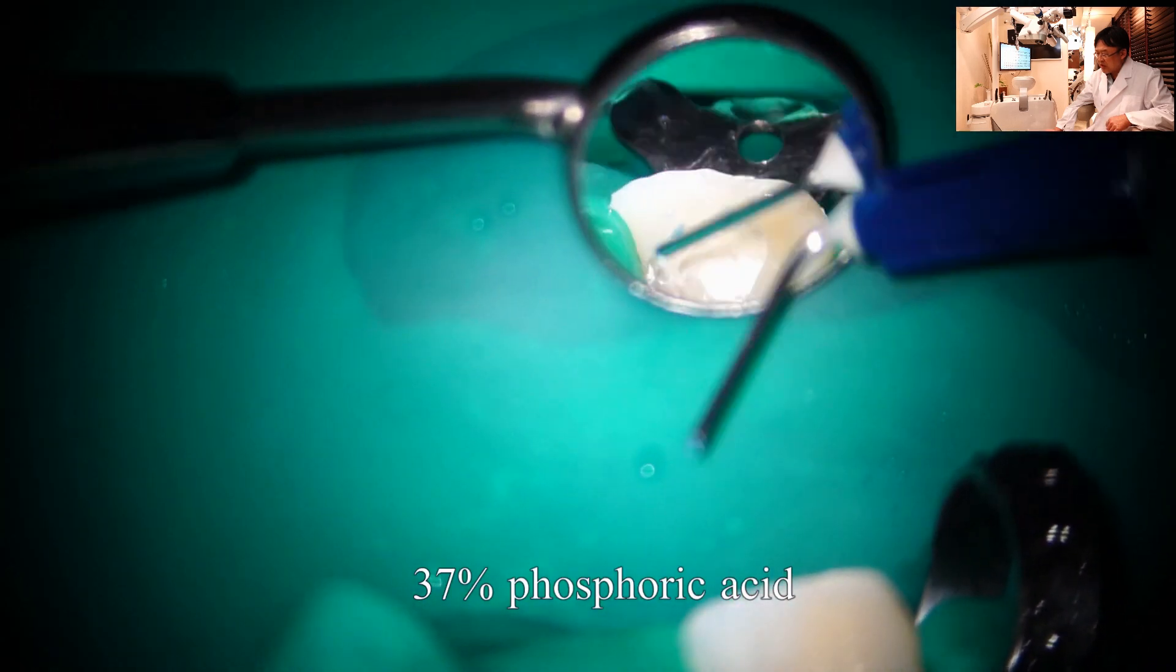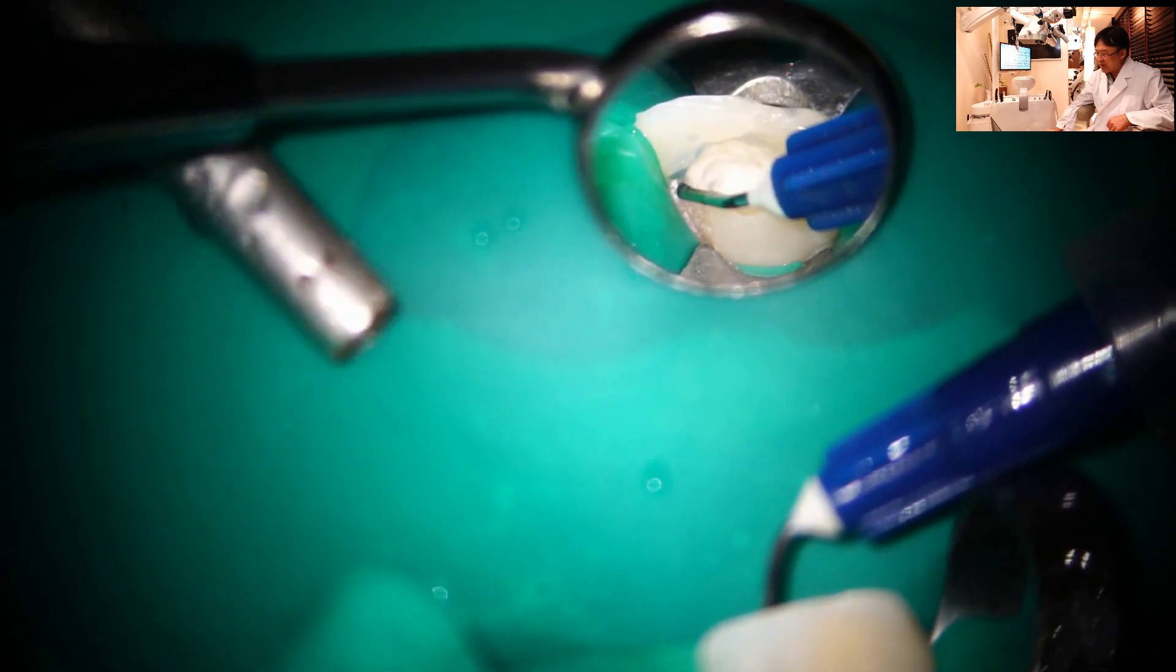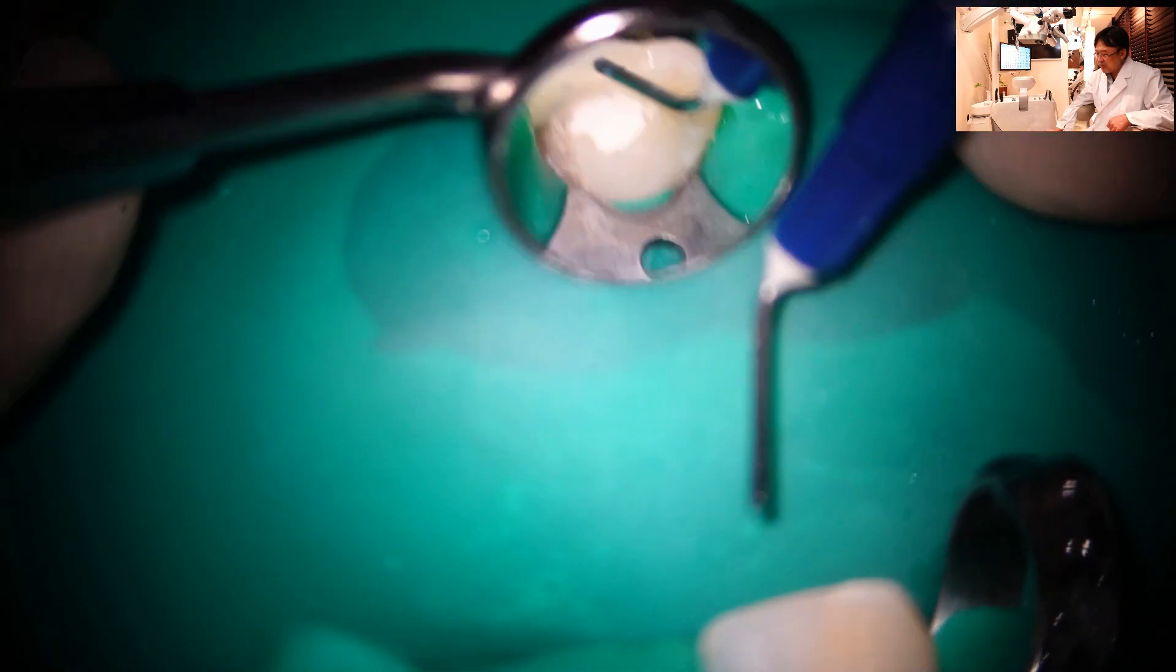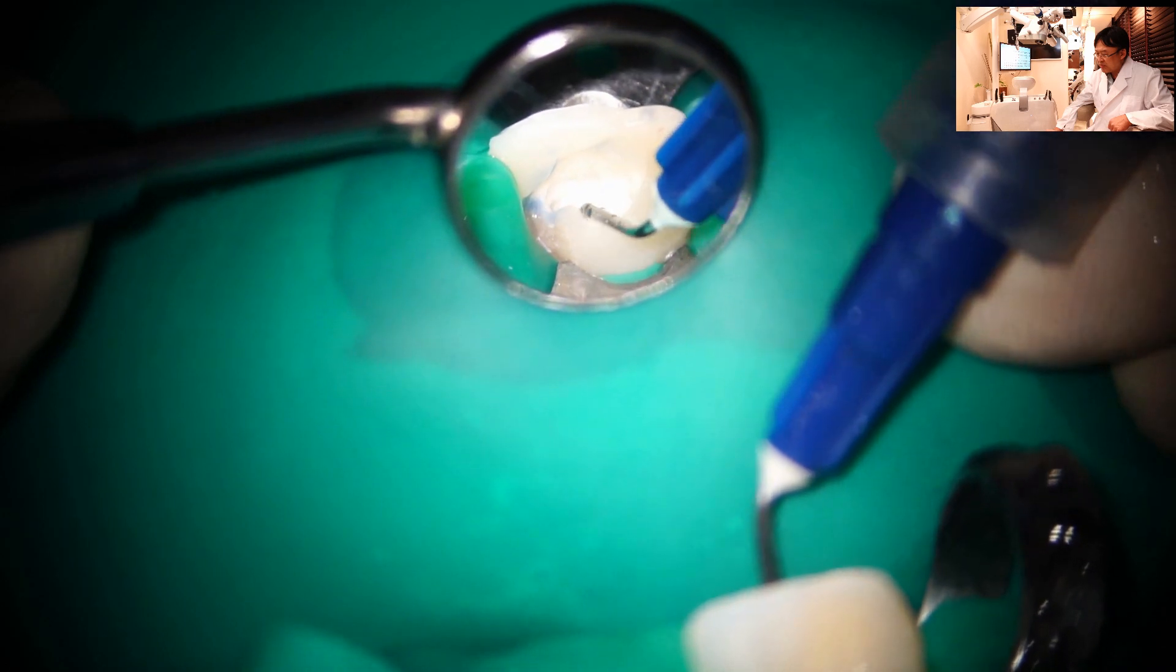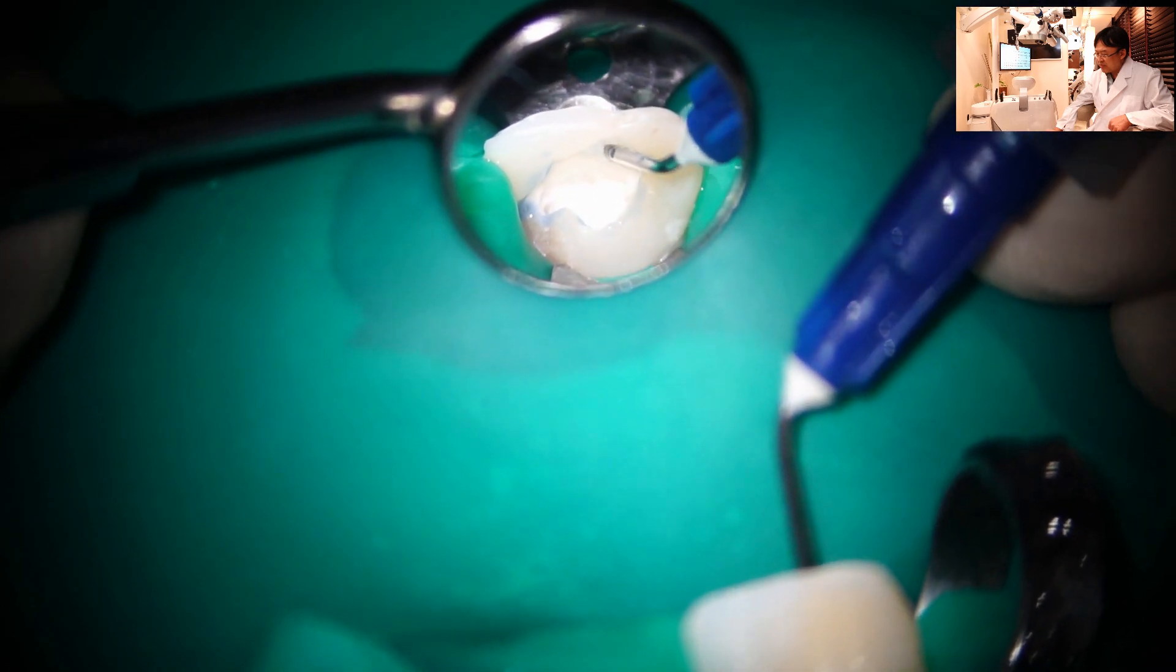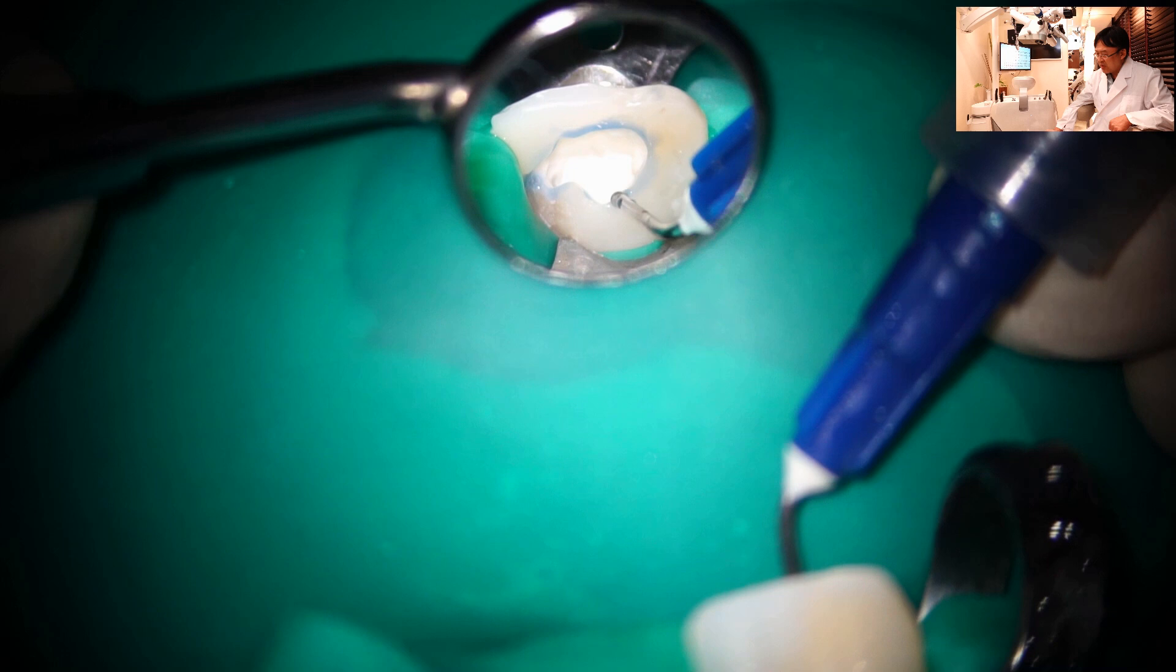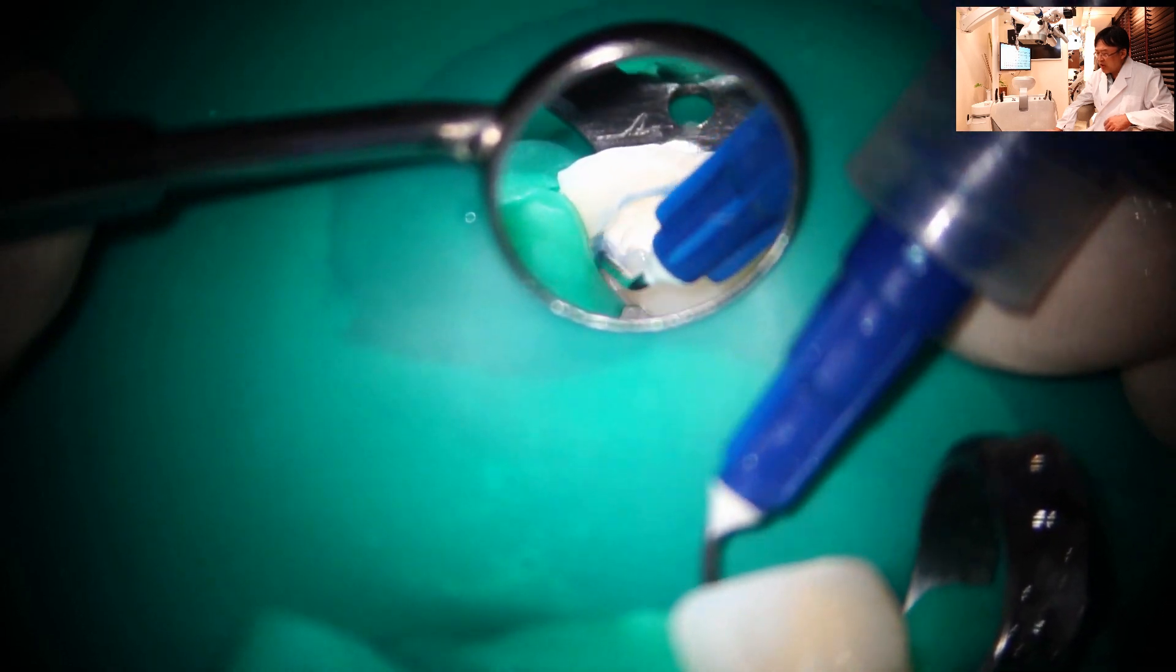This is 37% phosphoric acid. I'm putting it on enamel.